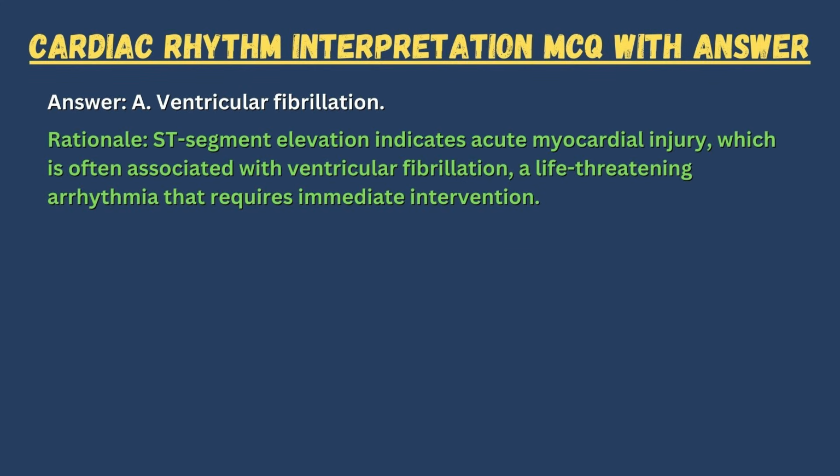Answer: A. Ventricular fibrillation. Rationale: ST segment elevation indicates acute myocardial injury, which is often associated with ventricular fibrillation, a life-threatening arrhythmia that requires immediate intervention.